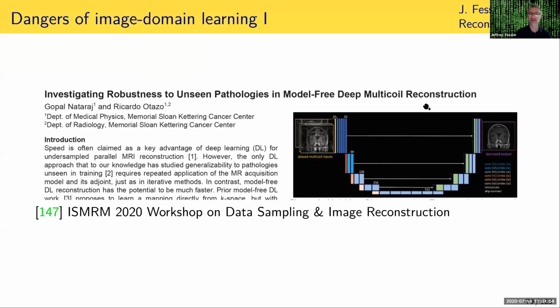And of course, you're using a more or less off-the-shelf looking UNet here. There very well may be improvements in image domain learning that can do a better job than this. I don't remember, for example, did they put the complex data in here, or did they put the number of, oh, it says 2 times NC. So actually that tells me right away they put the complex data, the real and imaginary parts, in here.